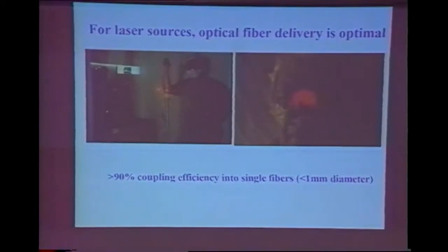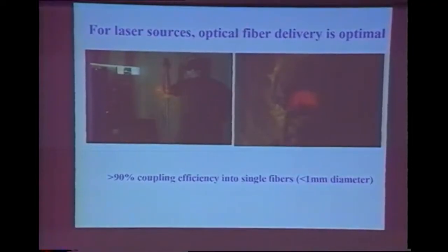From laser sources, optical fiber delivery is optimal, and this just shows a couple of examples. Typically, you get greater than 90% coupling into single fibers. And over the years, a number of different optical fiber configurations have been made.